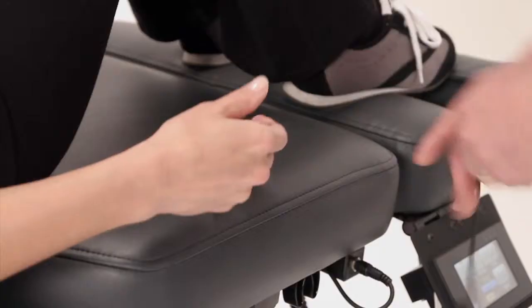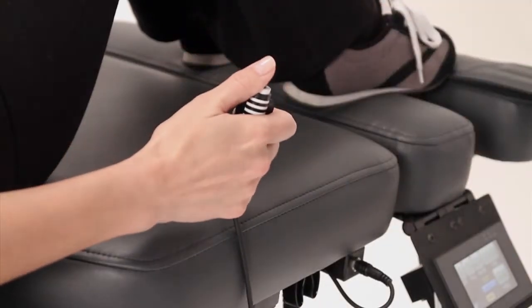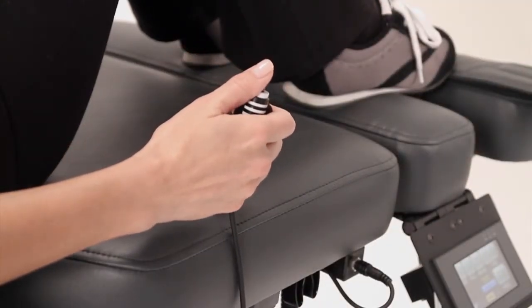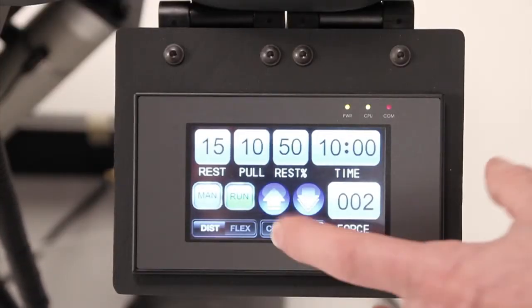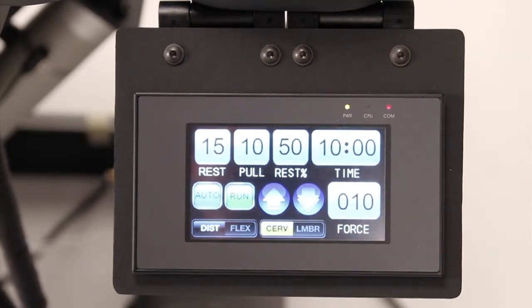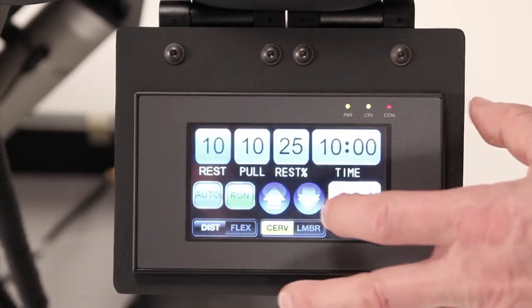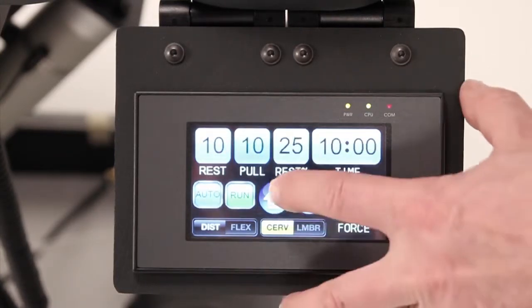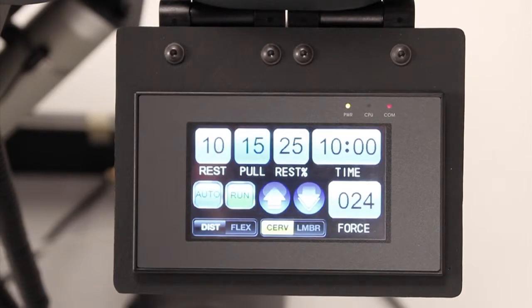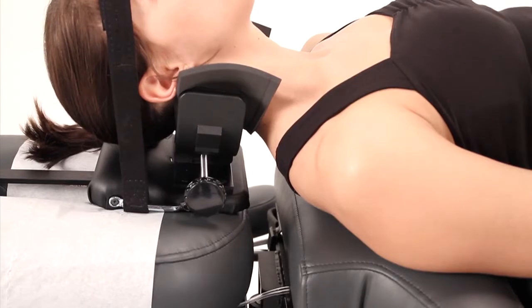If the patient experiences discomfort, they can use the emergency cutoff switch. The table will then stop the treatment and return to a full resting position. To program a cervical treatment, touch Cervical to activate the cervical mode. Settings for cervical distraction follow the same procedures as for lumbar distraction. Set your rest time, pull time, rest percentage, treatment time, and force. When all desired settings are entered, touch the green Run button to start the treatment.